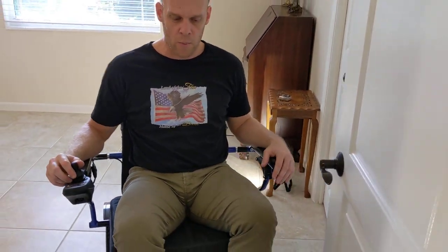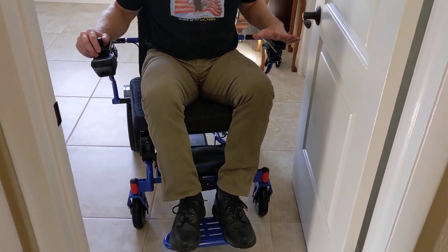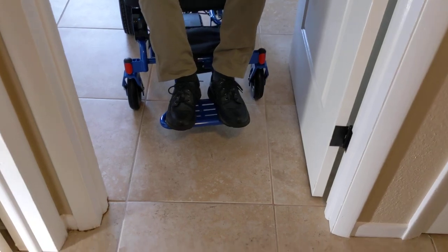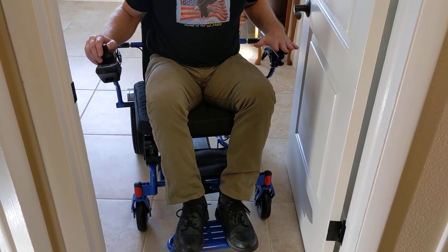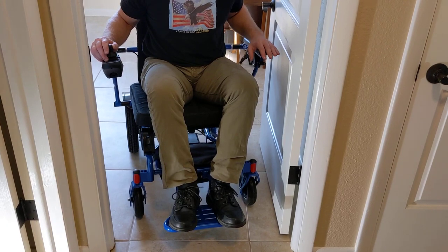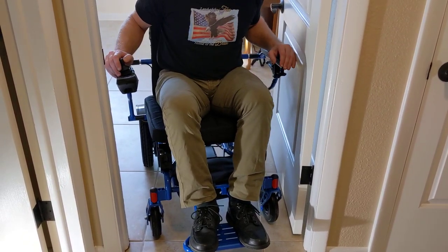I kind of have to approach this at a little bit of an angle. I'm watching my foot rests and I'm always watching the casters of the chair. I don't want to chew the bottom of the doorway up either. I'm very aware of where the arms of the chair are. I don't know if I'll be able to get out — I was able to get in. This may be one of the challenges with the armrest spacer extension kit.